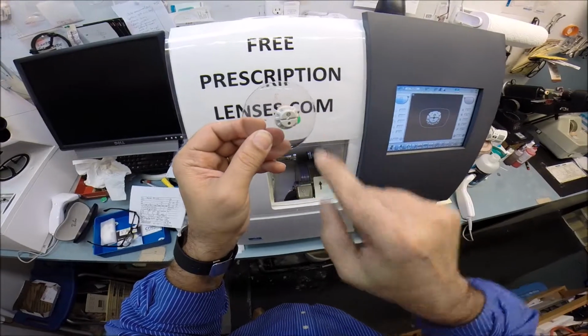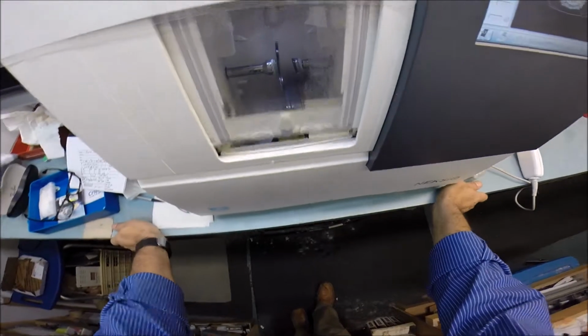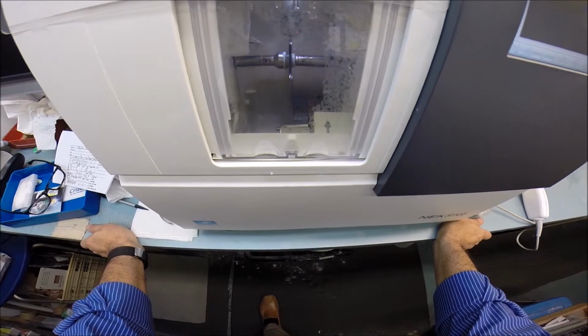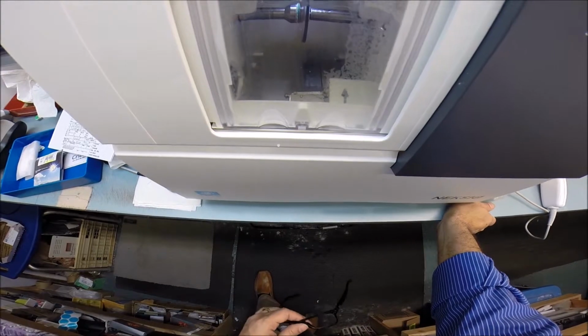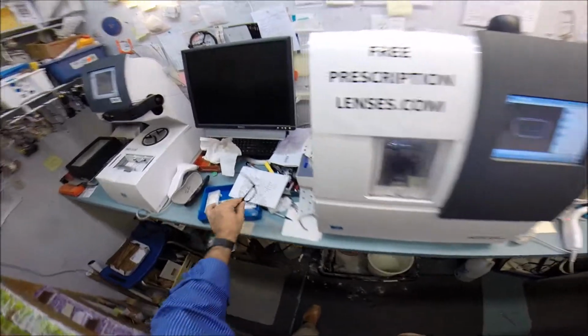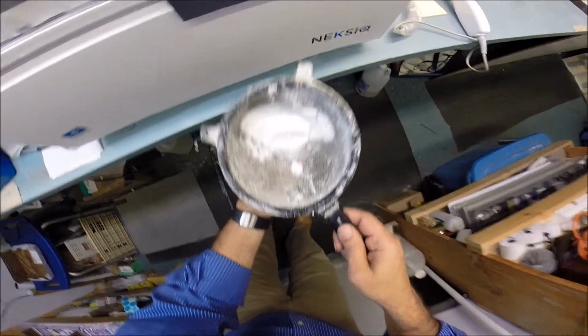So I'm hitting the L button, which stands for not right. Hey look, there's an L on here which stands for not right. Put that lens into the chuck and hit the start button. Just like before, the chuck's going to close, and the calipers are going to come down and trace the shape of the left side of your frame this time to make sure the lens is large enough to fit, and also to measure the lens. Of course, your lenses aren't thick, but I do cut a lot of thicker lenses, and it just knows where to place it inside. If you want to keep score at home, this is the material that was cut off of your lens. I'm going to put the trap back to collect the polycarbonate that is left over.